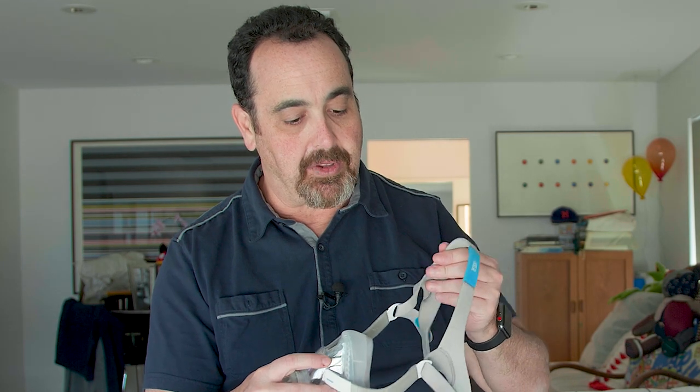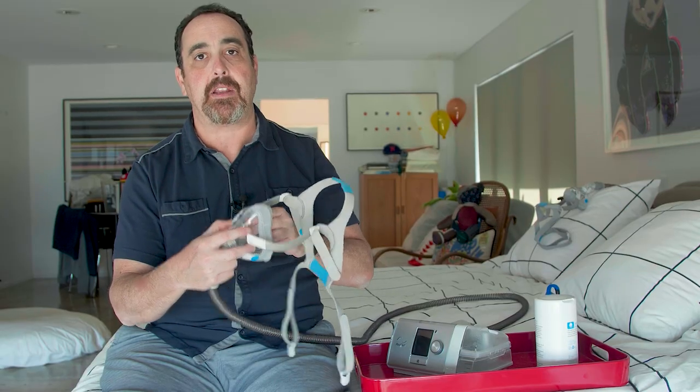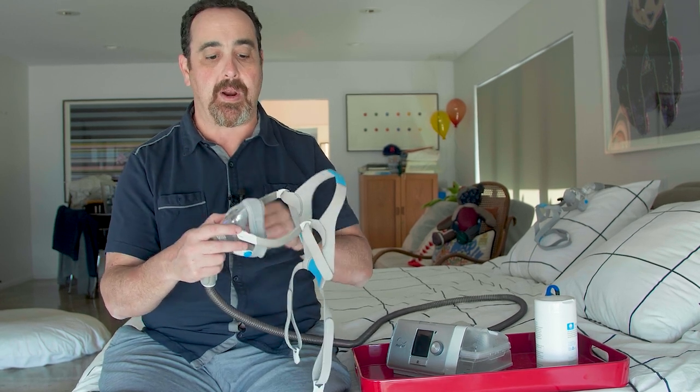My headband is much more comfortable now. Does my insurance give me enough reimbursable replacement parts? No — because of the pressure I'm at, I'm going to go through my resupplies a lot faster. If you think about it, they're getting more use at higher wear and tear.